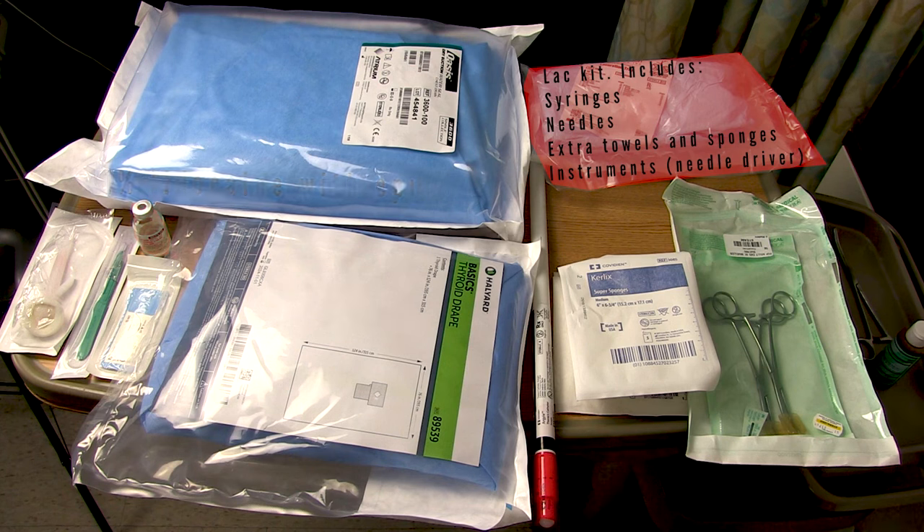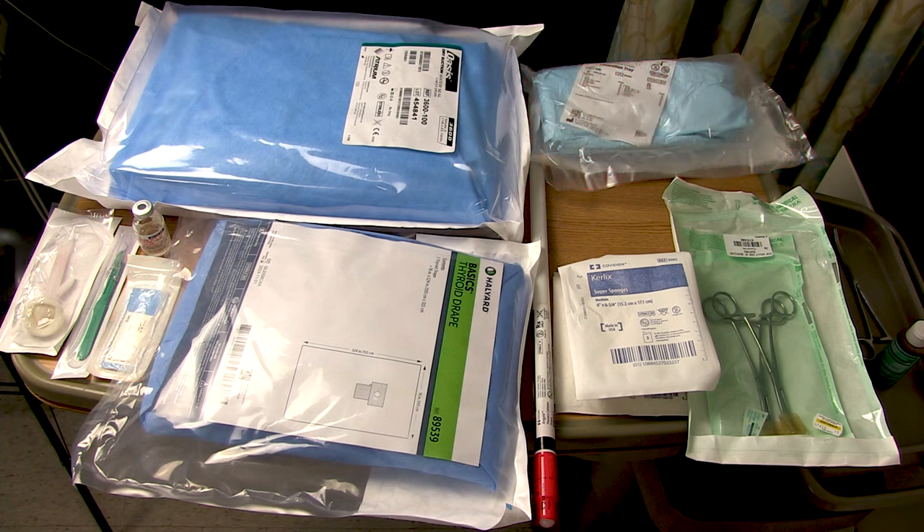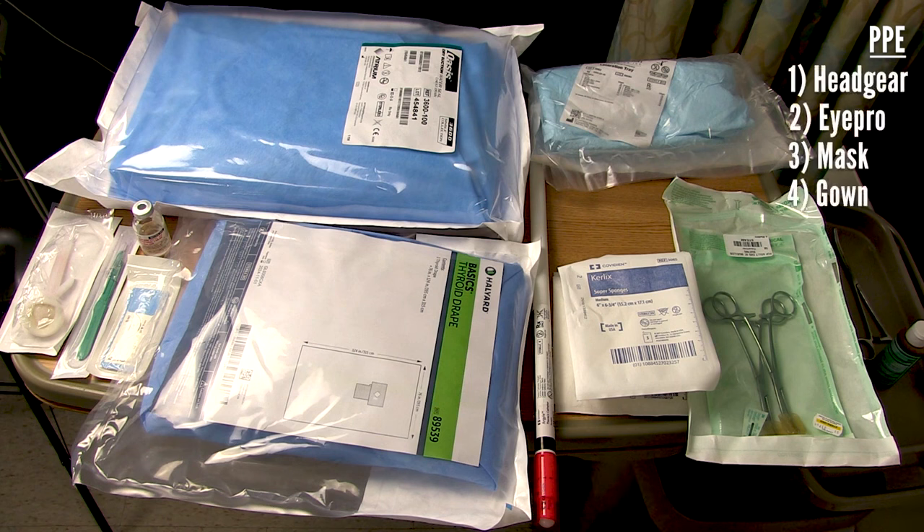You'll need something to sew your chest tube in with — I brought an O-silk on a cutting needle. You'll want it to be pretty big, like an O; if it's too small, you may break it when you're tying with it. You'll need a pair of needle drivers as well, which comes in my laceration tray. If you brought suture on a Keith needle, you may not need needle drivers. Last but not least, you'll need some PPE — grab some headgear, eye protection, a mask, and a gown and gloves.